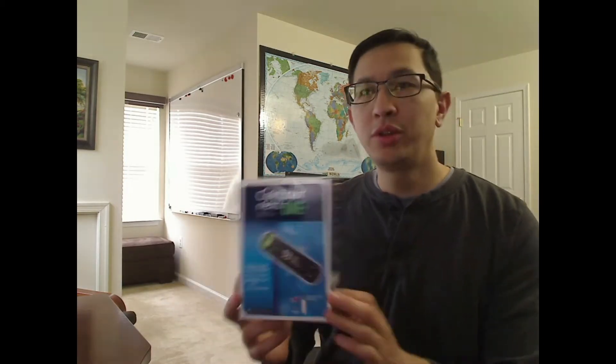Hello, this is Steven. Just wanted to do a quick review of the Contour Next One Glucometer that I got from Maddie Nielsen on YouTube. She gave this to me, so I just wanted to do a quick review of this as my first video.